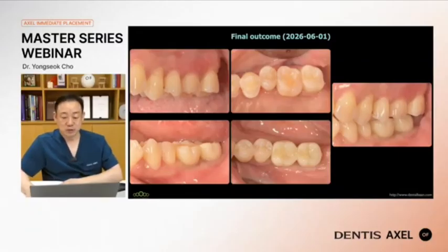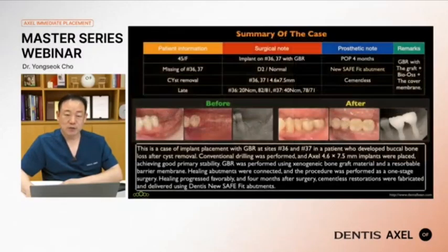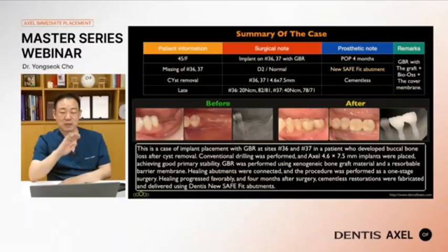Looks very clean condition in soft tissue, and in radiographic image looks good. Although it is very short term follow-up, I feel it looks nicely finished. Maybe GBR is a supplementary process in such an occasion. If we omit GBR, still implant will survive, but to increase the labial tissue volume, GBR will be necessary.